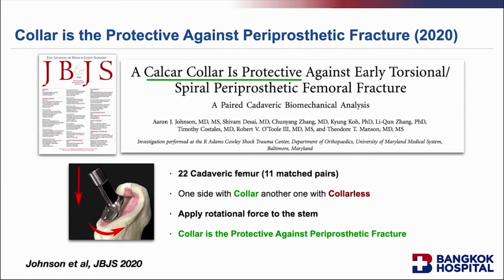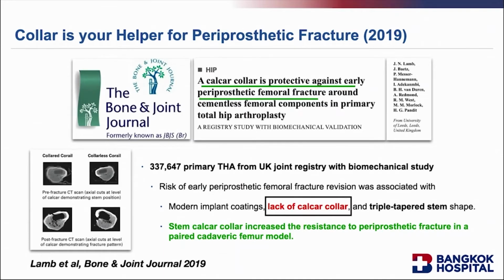The cadaveric study from JBJS 2020 also confirmed that the collar is protective against periprosthetic fracture. The data from the UK Joint Registry, published in 2019, show that the calcar collar increased the resistance to periprosthetic fractures.